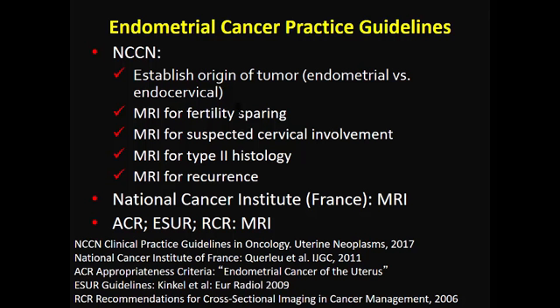So, finally, NCCN, this is the 2017, just out of the press, it does recognize the role of MRI in several indications, and that's quite an achievement from the imaging community: to establish the origin of the tumor, endometrial versus endocervical, when you have an endometrioid cancer pathology.